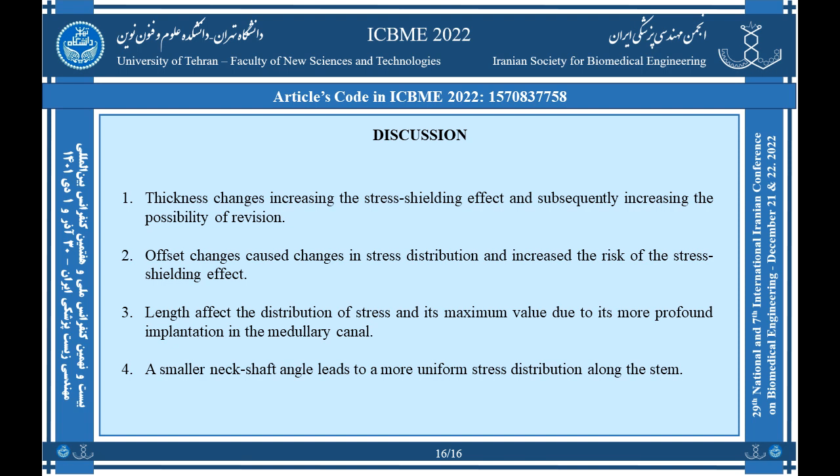It was also observed that implant C, with a lower neck shaft angle compared to the other models, behaved more uniformly in stress distribution along the stem. Therefore, it can be concluded that a smaller angle leads to a more uniform stress distribution along the stem.